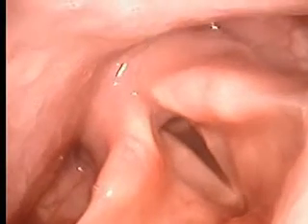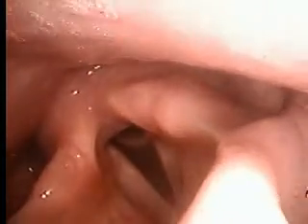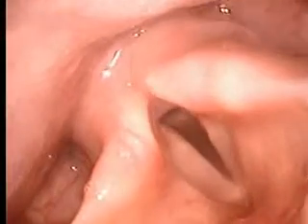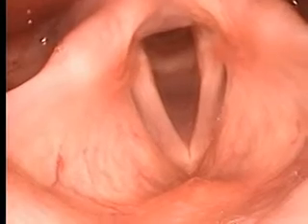The true vocal cords should appear clean, white, and taut. Note throughout any mucosal color or superficial irregularities. While the patient is breathing deeply, the glottis should remain widely open, with the vocal cords abducted. Usually some portion of the subglottic larynx can be seen. The anterior ring of the cricoid cartilage is often visible just below the true vocal cords. The laryngoscope should not be passed through the vocal cords, since contact can elicit laryngospasm.